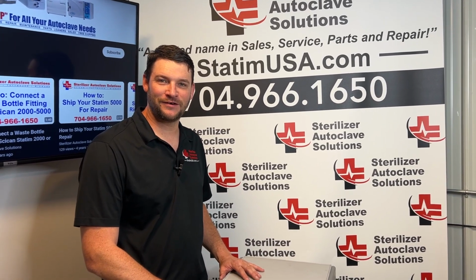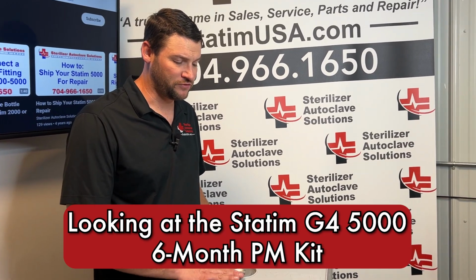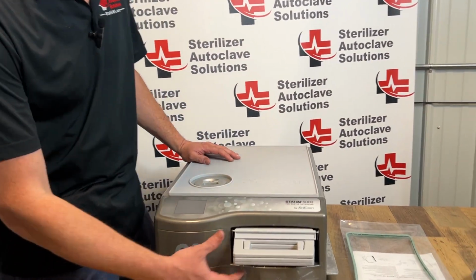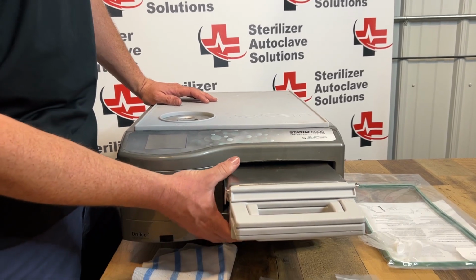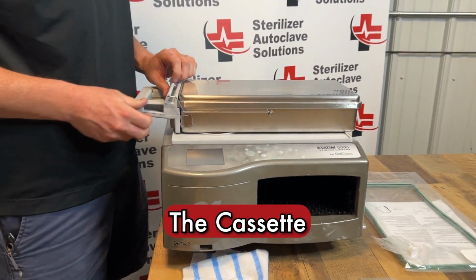Hi, this is Ian with Sterilizer Autoclave Solutions, and today we are doing our 6-month preventative maintenance on a Statim G4 5000. The G4 and the Classic will have the same kit. We're going to start off with the cassette.